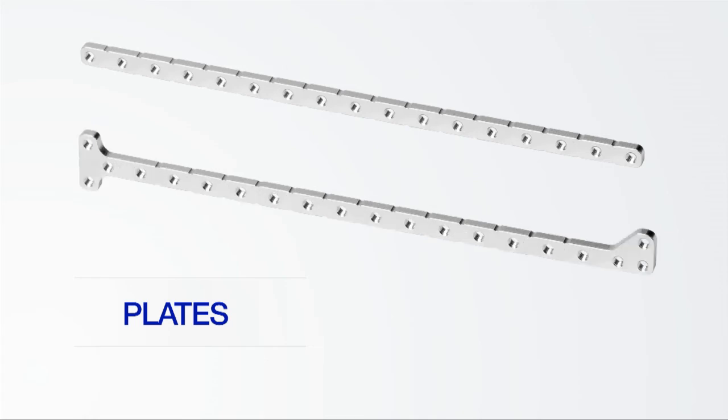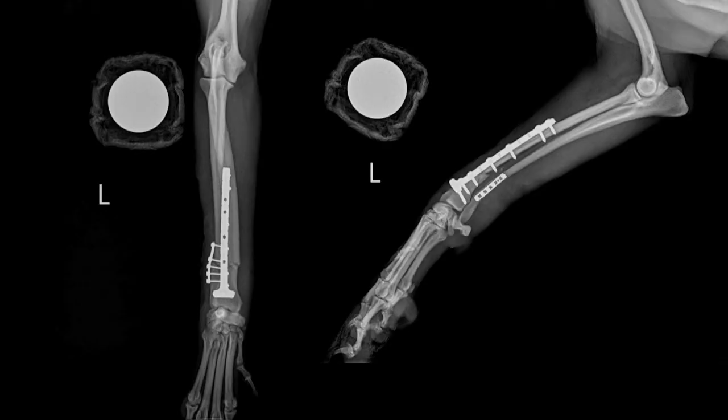Each VetKISS plate size is available in a rigid and an X, or reconstruction plate, option. Rigid plates are considered the go-to plate for everyday use and should be utilized in the majority of VetKISS applications. X-plates should not be used as a solitary plate in load-bearing applications and are only occasionally considered clinically appropriate.